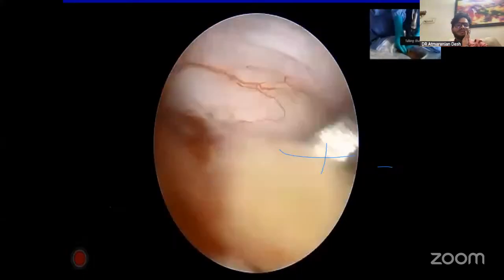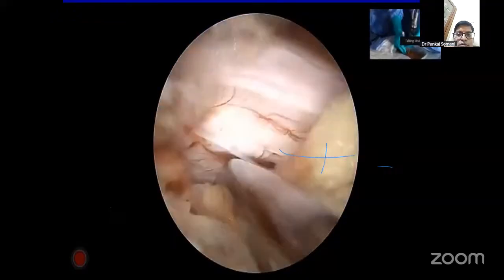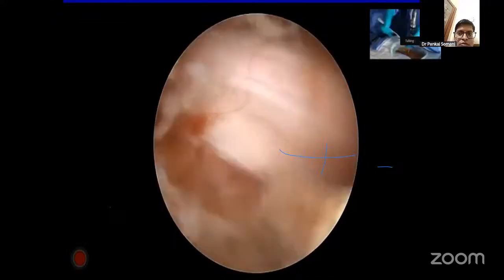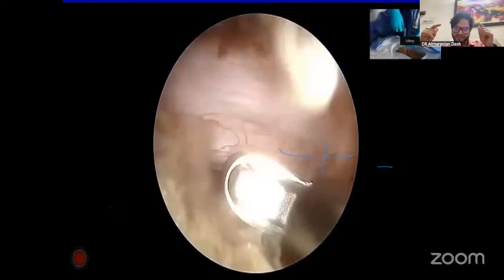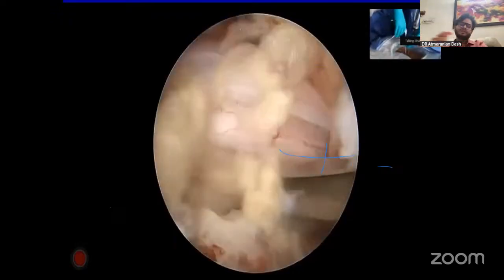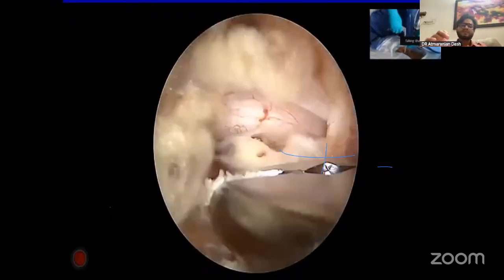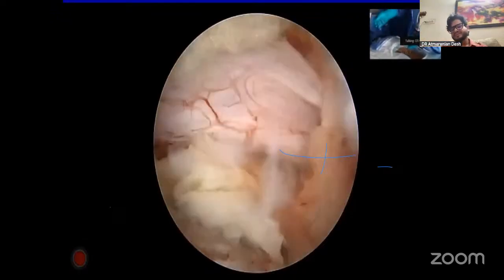So all these elderly patients, in their 70s, 75, 80s, are now willing for surgery, because we are saying we are not going to put a single screw on the back. If the integrity of the canal is intact, we can do this foraminal work, we can remove the flavum, we can still do multi-level hemilaminectomies, and the integrity of the spinous process will be intact, because the muscle and interspinous ligament we don't touch.